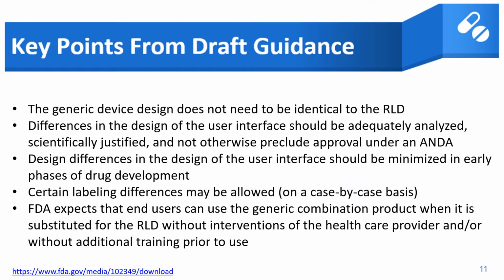Some of the key points from the draft guidance include the fact that the generic device does not need to be identical to the RLD. The differences in design of the user interface should be adequately analyzed, scientifically justified, and not otherwise preclude approval under an ANDA. Some design differences in the design of the user interface should be minimized in the early phases of drug development.